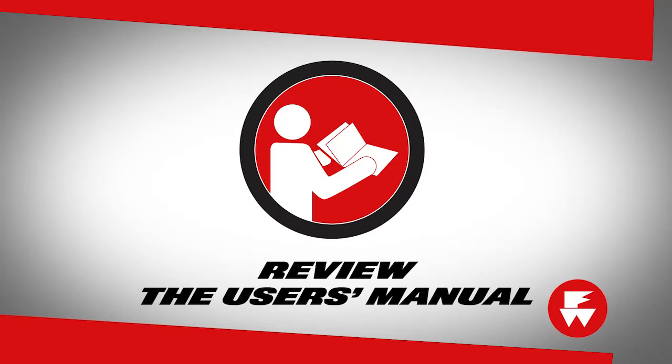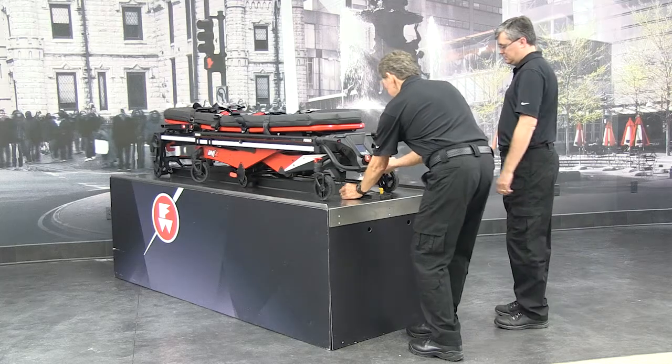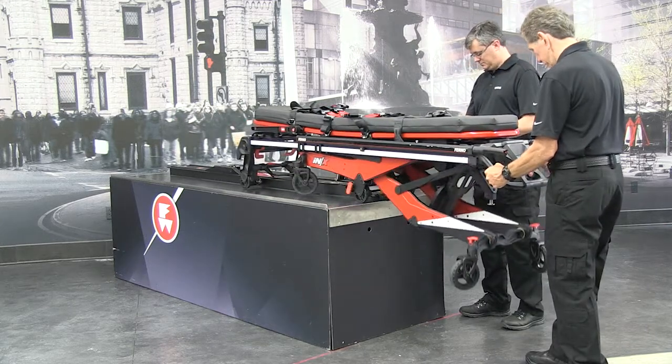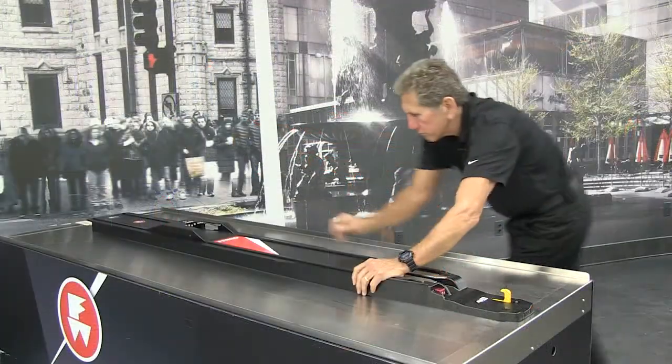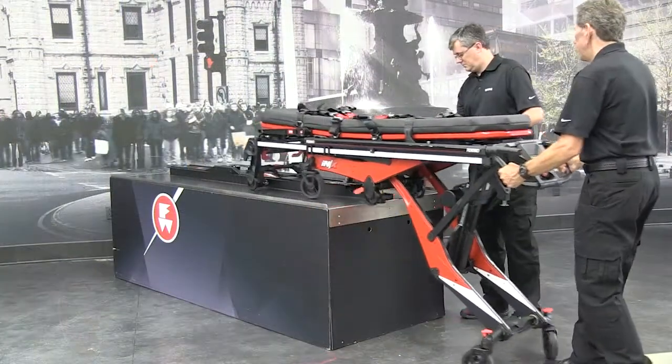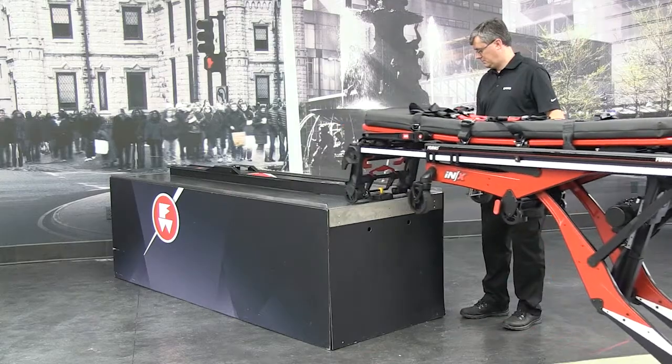Before use, personnel who will work with the fastening system must read and understand the inline fastening system user's manual. Appropriate skills and training are also required. Confirm that the system works properly. Confirm that the system is securely locked to the floor of the vehicle. Use only compatible FERNO products.